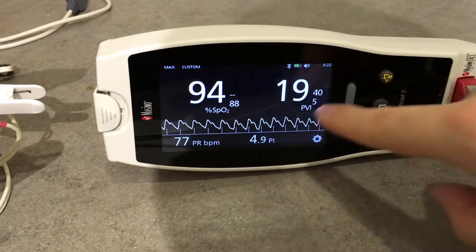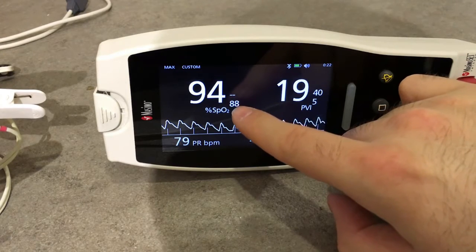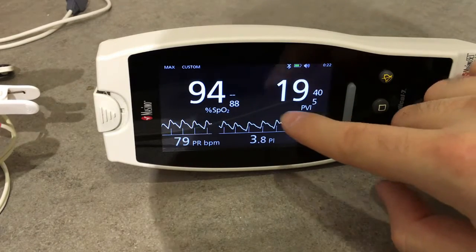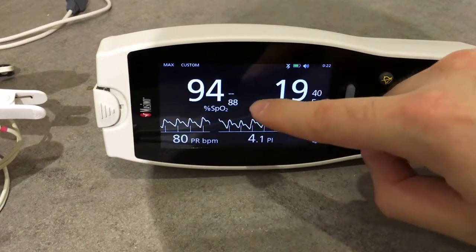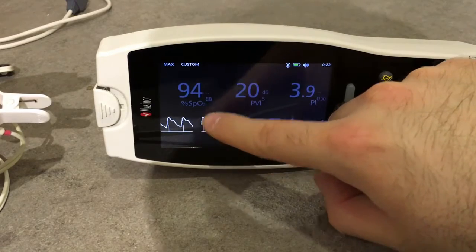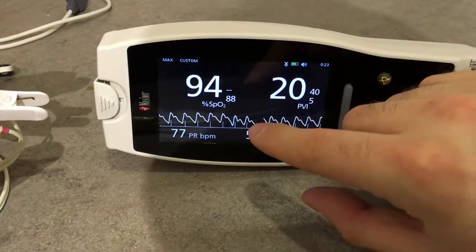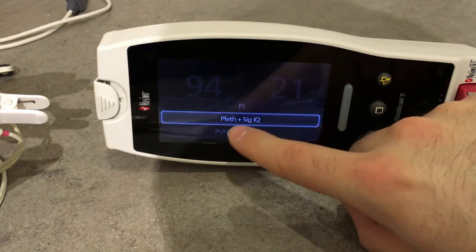On the central part of the screen we have these values: SPO2 with its maximum and minimum alarms, and the Pleth Variability Index with its maximum and minimum alarms. We can drag and drop these values to another part of the screen — it's entirely customizable. We can also have pulse rate and pulse index displayed, as well as the plethysmograph plus Signal IQ.